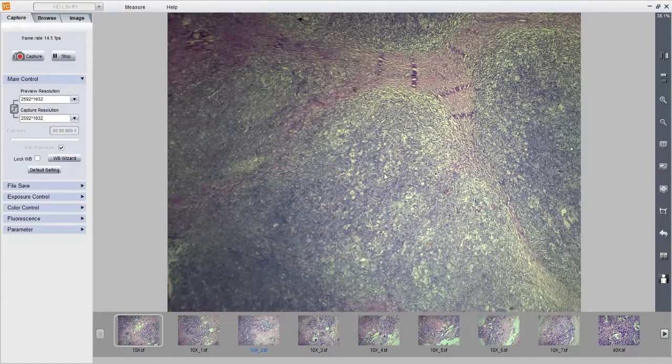The time that you have to spend the most is in 4x. In any lymphoma case, spend 90% of your time in 4x and then come to 10x or 40x just to confirm what you have seen in 4x. The scanner view is the most important magnification for the diagnosis of a lymphoma. I've already made this diagnosis in my low power 4x. I've seen a thickened capsule going into fibrous septa, separating it into large nodules. Then I'm seeing these large scattered cells in a reactive lymphoid background. I've already made my diagnosis. I'm going to just confirm it in high power.